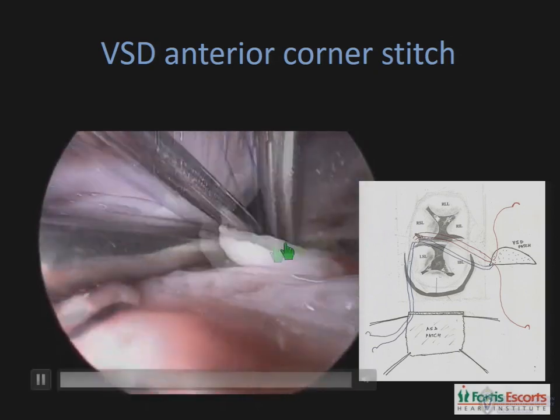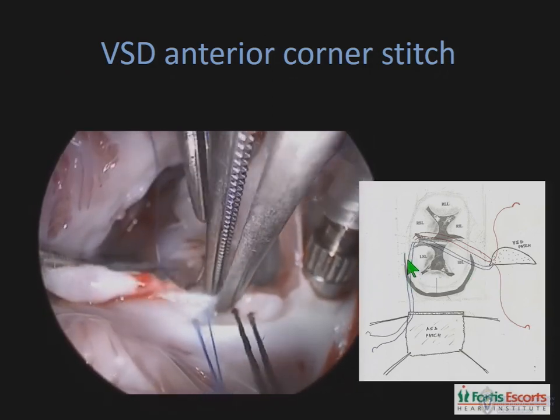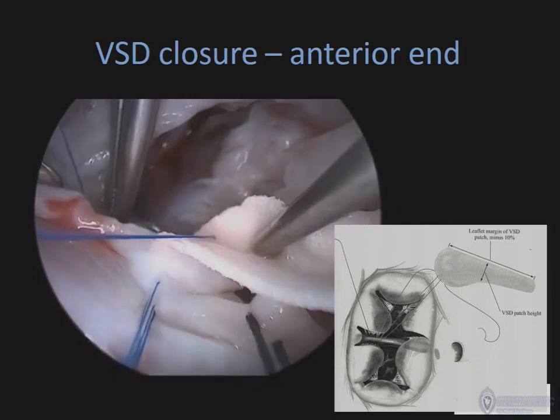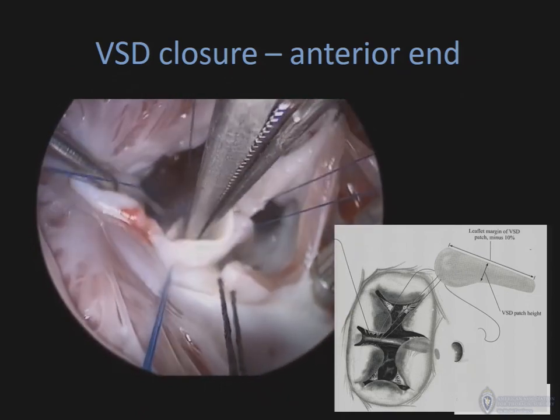We start off placing the anterior stitch of the VSD patch, and this is crucial because that's the area where one is likely to have a residual VSD. So we take two sutures. The first suture goes through the patch, through the bridging leaflet, and on to the ASD patch. The second suture, which forms the continuous suture line of the VSD, again goes through the patch, goes through the uppermost extremity of the ventricular septal defect crest, and then the patch is sunk down. After that, the anterior suture line continues — a continuous suture line walking along the crest of the anterior part of the interventricular septum.